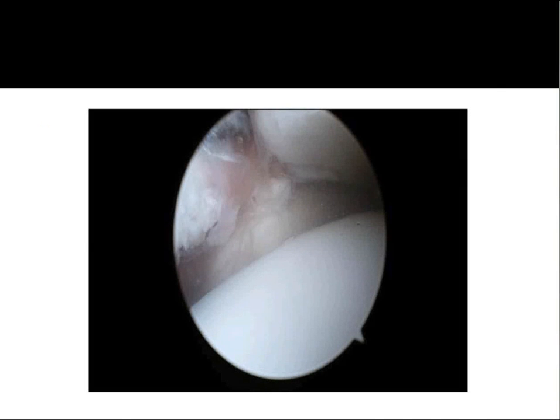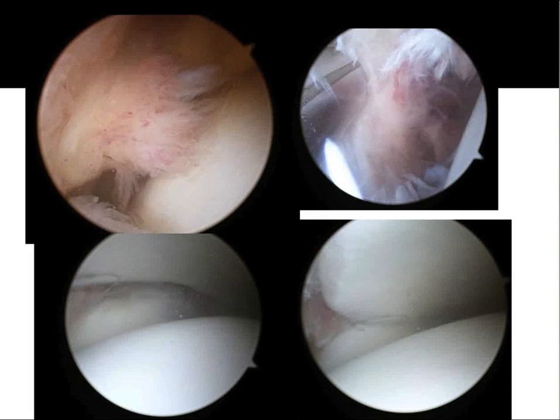We'll see if this works. These are some static pictures. So this is an arthroscopy, and you can directly probe. You can see there's maybe even a small chondral lesion there. There's definitely opening there of 1 to 2 millimeters. And on the video, you'll see by applying an external force, just moving the fibula around, there's massive translation. You can get not just widening, you can get abnormal translation in anterior and posterior planes as well.